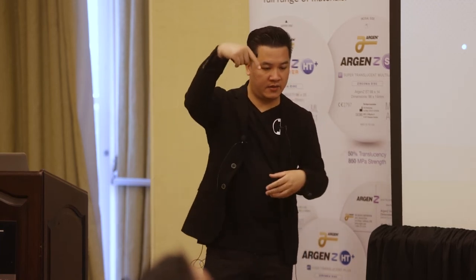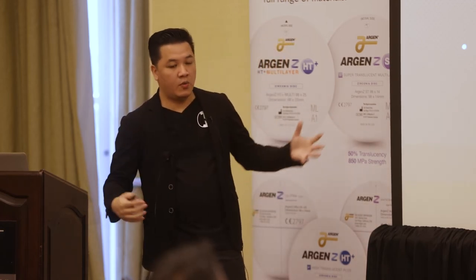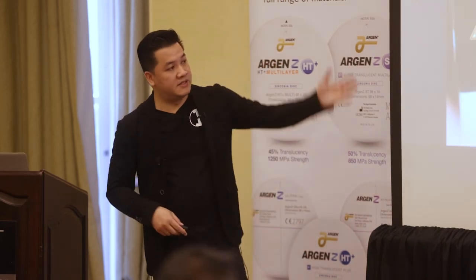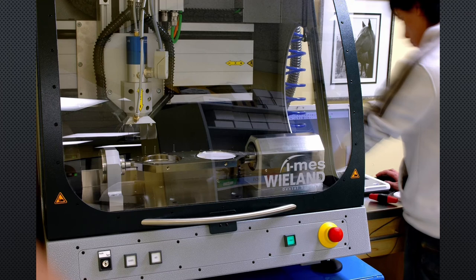The problem is you're very limited by tool geometry, right? If you have undercuts or anything like that, you're limited by how that machine can move. And of course, there's a lot of waste. With reductive, there are a lot of things that are just time consuming. Milling dentures is something I've always thought was kind of a dumb business model, but it does make sense if you're using it just to complement your crown and bridge, or if you're a denturist. So this is me back in 2006, and this was the machine that we had.